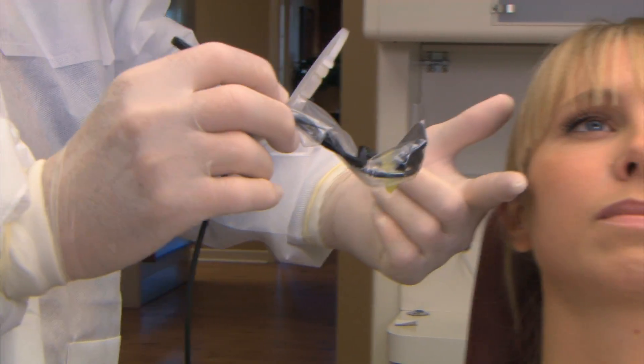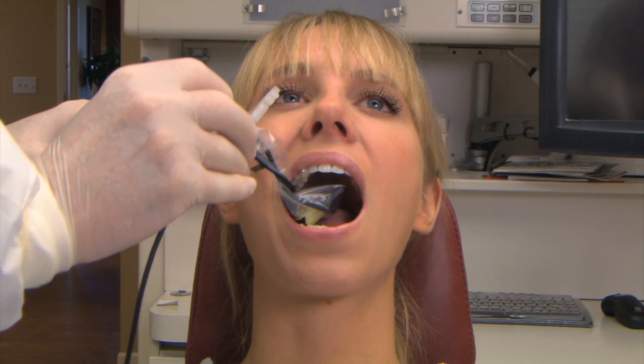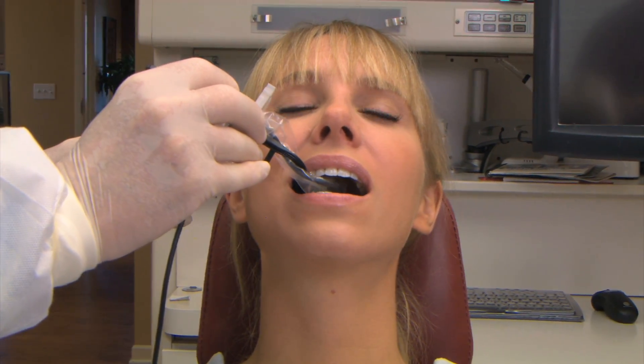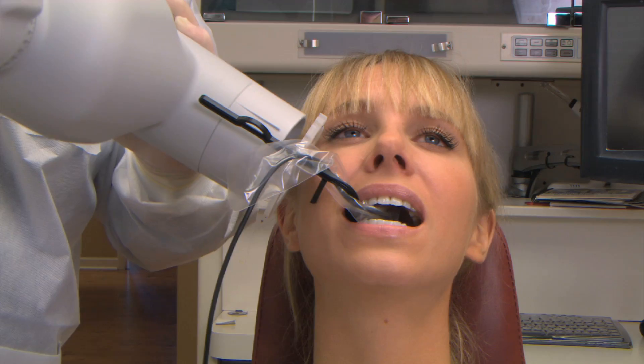Go in on a 45-degree angle into the lingual side of the tongue. Place the sensor, turn, and push to the midline. Tell the patient to close gently. Position the cone up against the aiming ring and take the x-ray.